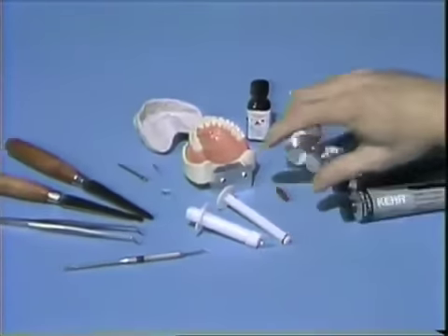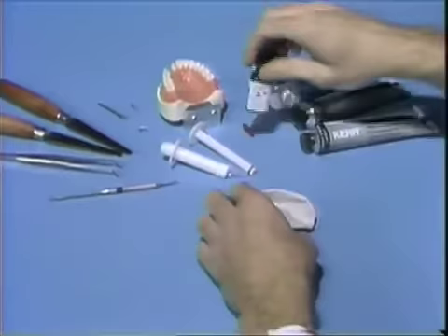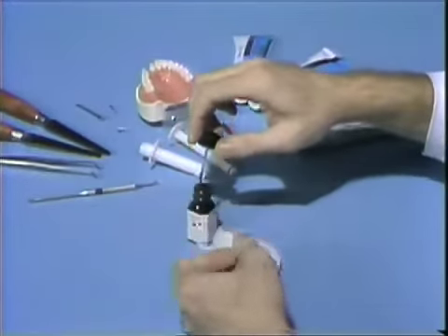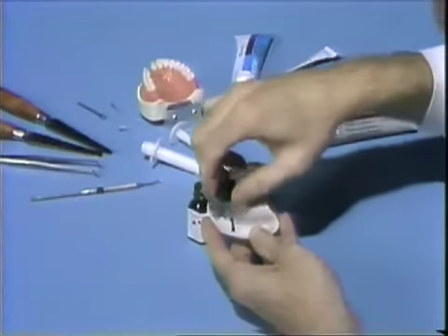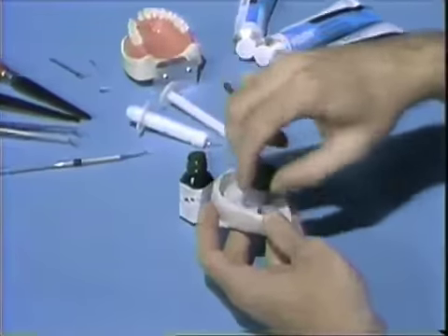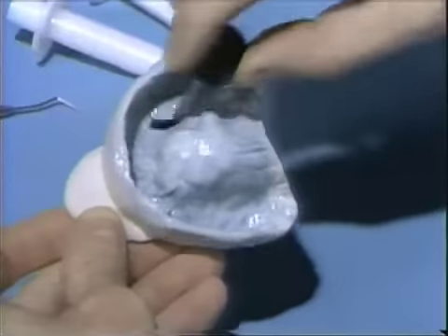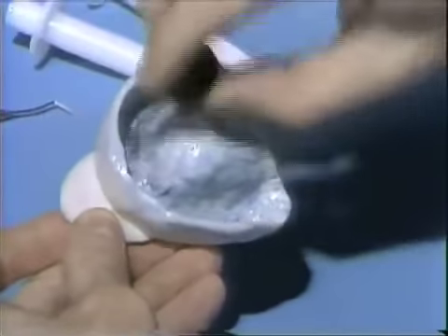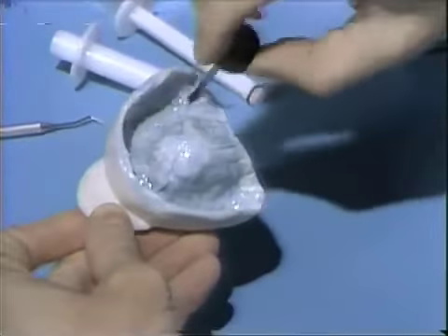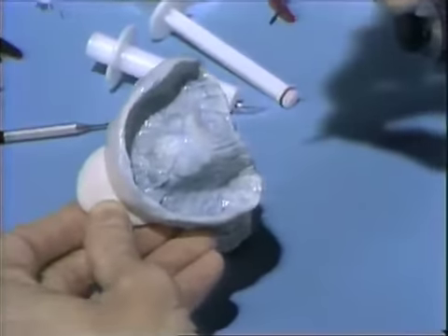Let's first take the custom impression tray and begin by painting the adhesive on the inside of this impression tray. We've finished painting the tray, and notice we have a thin layer everywhere and we haven't allowed the adhesive to pool in any areas. We're going to set this aside and let it sit for at least 20 minutes before we're able to use it and get all the adhesive qualities out of this material.